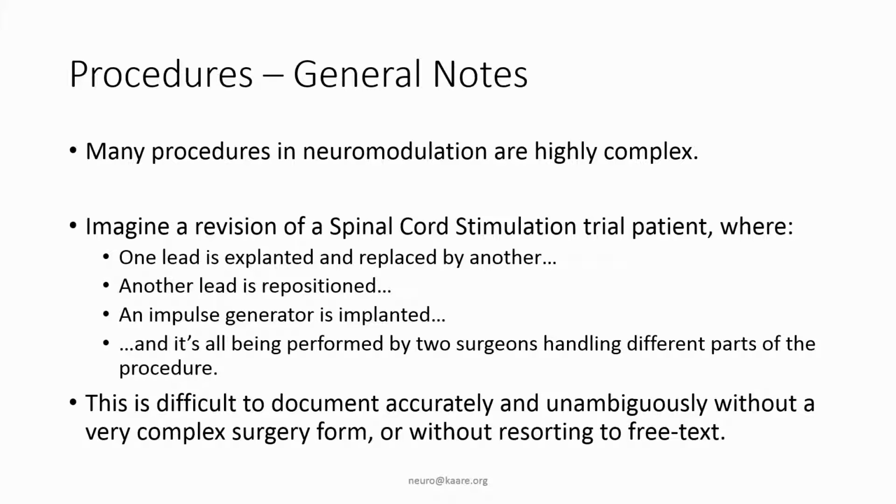Let's just, as an example, imagine a revision of a spinal cord stimulation trial patient where you explant one lead and replace it by another, you reposition or revise another lead, and you implant an impulse generator. That's all being performed by two surgeons who handle different parts of the procedure.